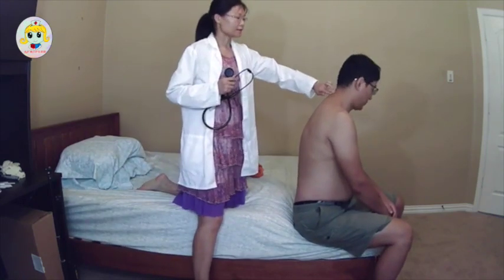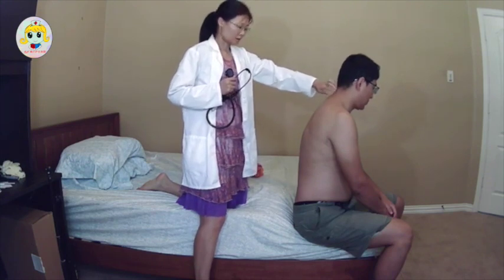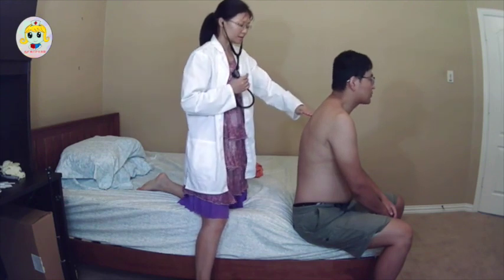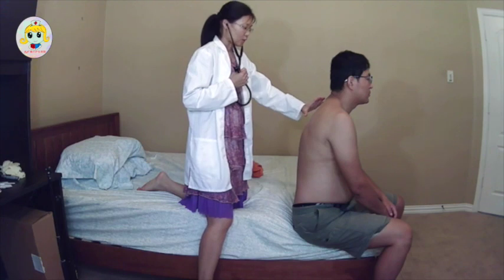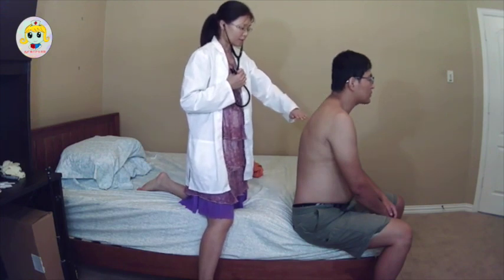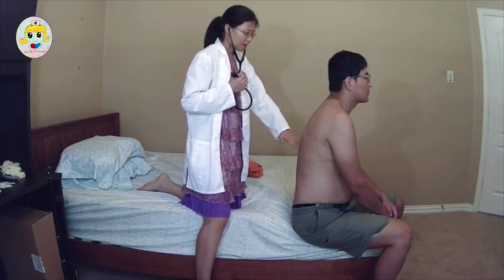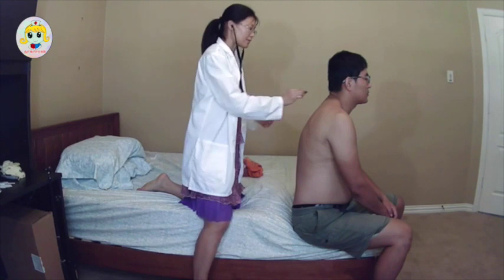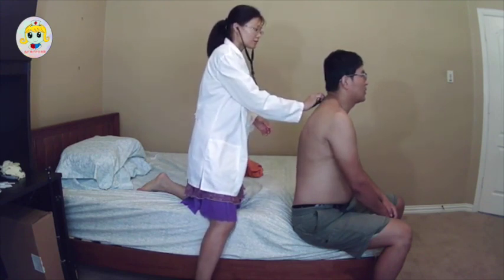Here is the C7. This is the bone prominence. You could not miss it. And between the shoulder blades is the T3. Between C7 and T3 is the upper lung lobe, and below T3 is the lower lung lobe. I will use the diaphragm of my stethoscope. Deep breath for me. Thank you.